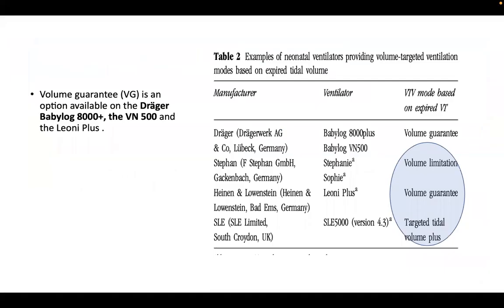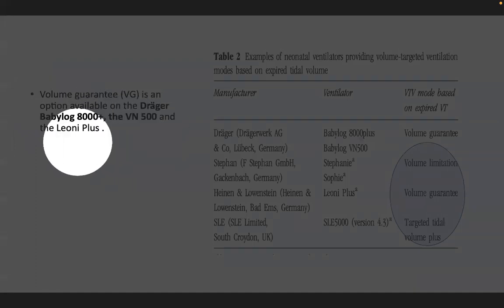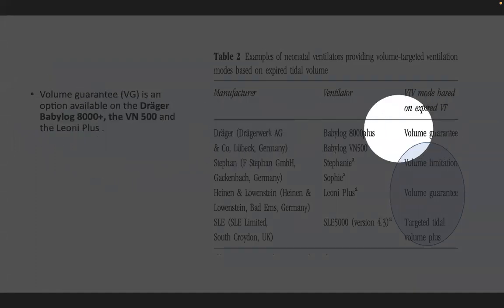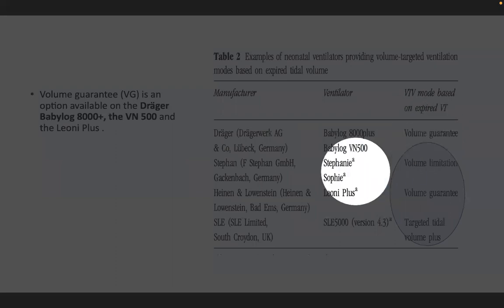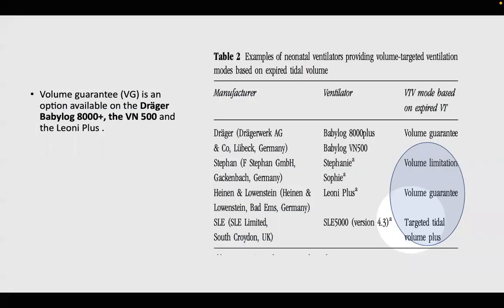So, as can be seen here, volume guarantee is an option available on the Dräger Babylog 8000 Plus, the VN500 and the Leoni Plus. In Dräger, it is known as volume guarantee, and in SLE, it is known as targeted tidal volume plus.